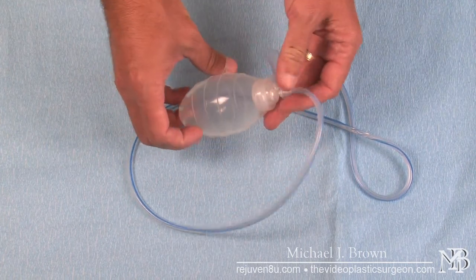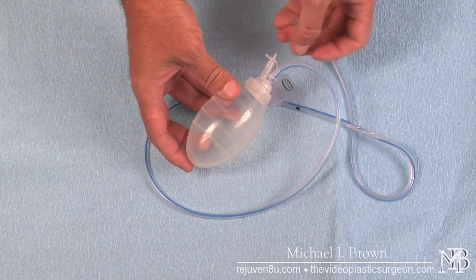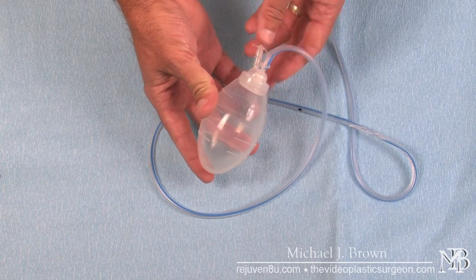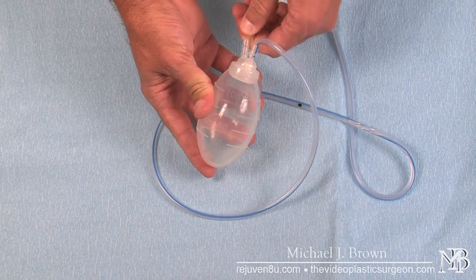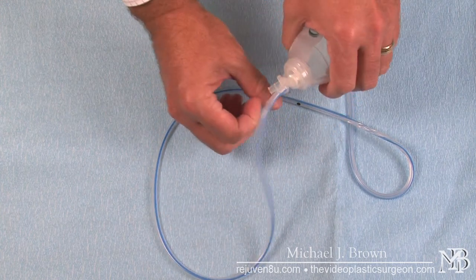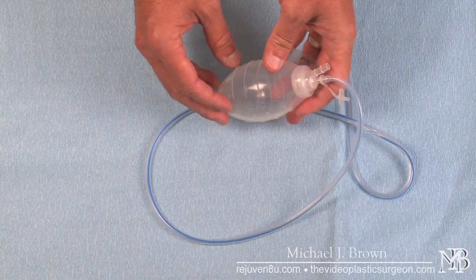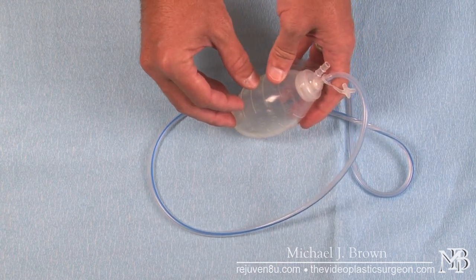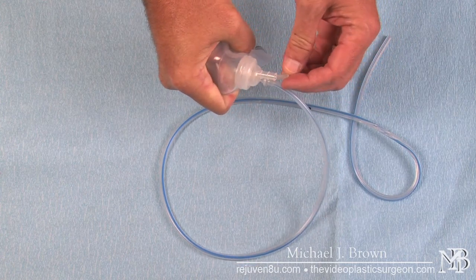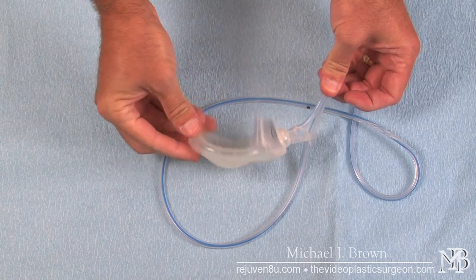The reservoir will fill up over time and will need to be emptied. The way it is emptied is similar to what I demonstrated earlier — the cap is removed, the volume is squirted into a container, and the container volume is recorded to figure out how much has been emptied. Then the bulb is compressed and the cap is put back. Because it's under suction, it will stay compressed like this.